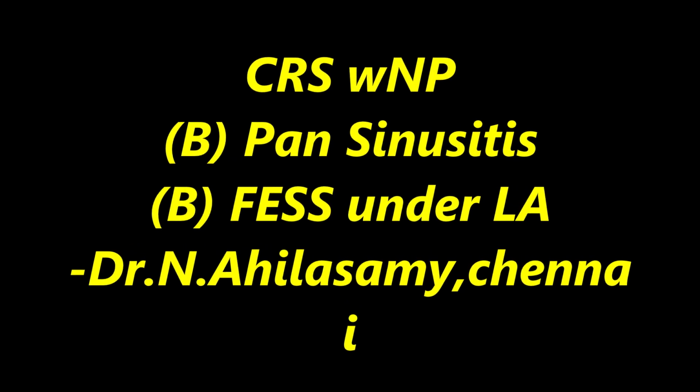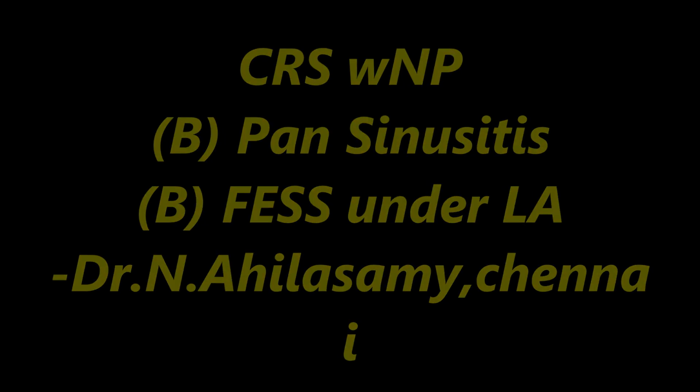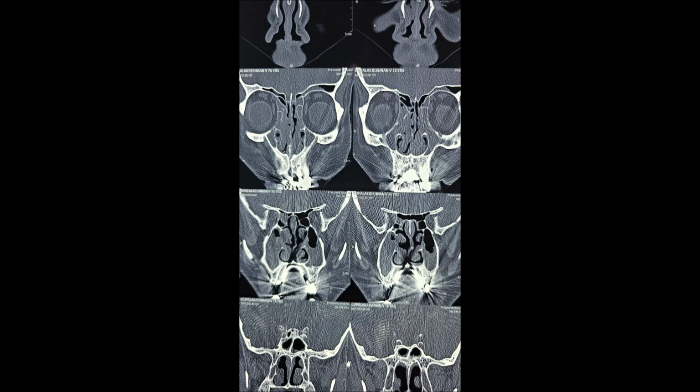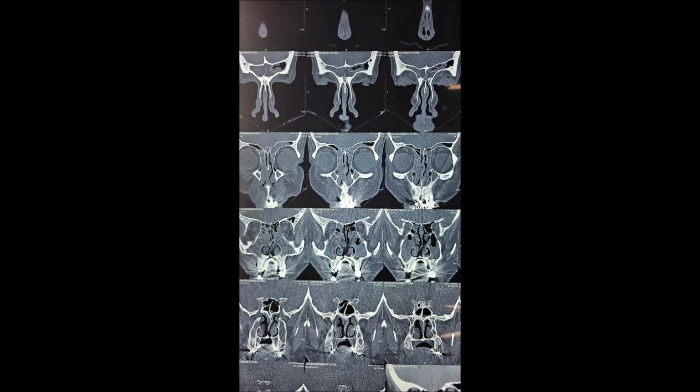I am going to show a case of CRS with nasal polyposis and sinusitis. You can see the CT scan coronal images. All the sinuses are involved, both sides except the sphenoid sinus. So I will be doing a bilateral complete FESS except opening the sphenoid, which is not needed in this case.